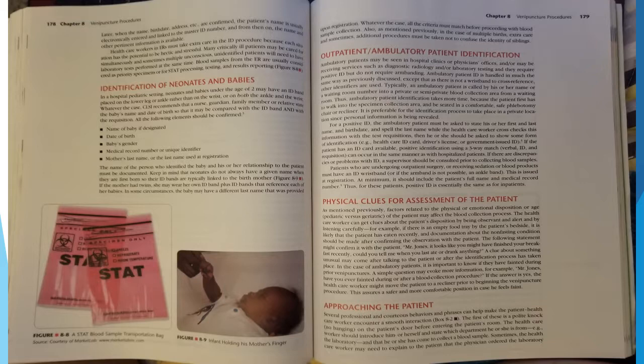In the case of ambulatory patients, it is important to know if they have fainted during prior venipunctures. A simple question may evoke more information. For example, Mr. Jones, have you ever fainted during or after a blood collection procedure? If the answer is yes, the healthcare worker might move the patient to a recliner prior to beginning the venipuncture procedure. This assures a safer and more comfortable position in case he feels faint.